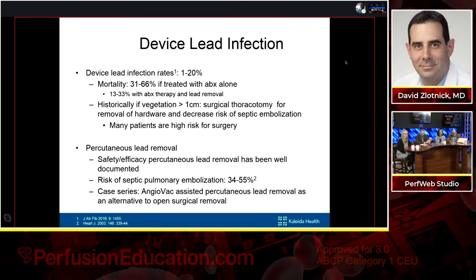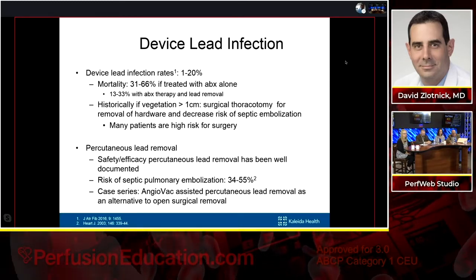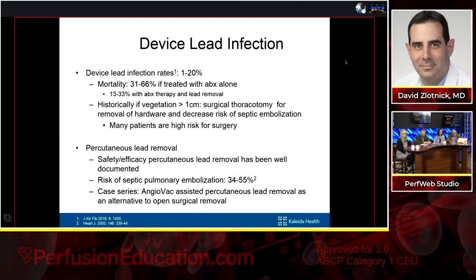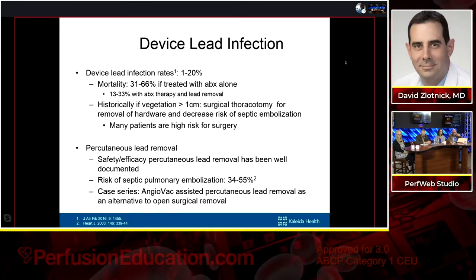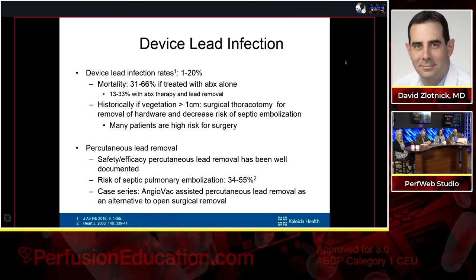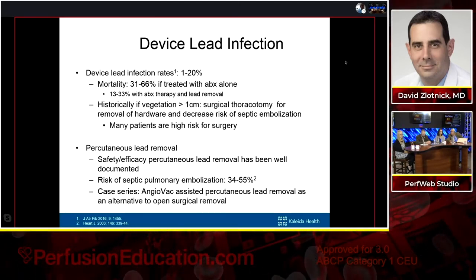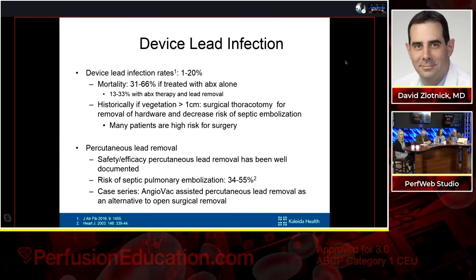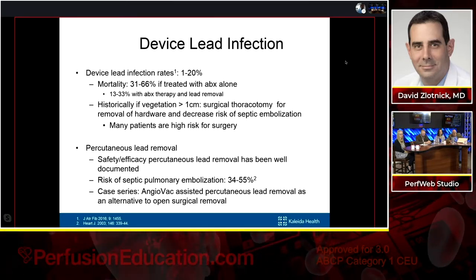So historically, if a vegetation is greater than 1 centimeter, surgical thoracotomy for removal of the hardware is performed to decrease the risk of septic embolization. However, if you think about our population, especially the aging population, who's getting pacemakers and defibrillators? It's usually the elderly. And these are high-risk patients to bring back for surgical thoracotomies and sternotomies. So percutaneous lead removal has been developed as a safe and efficacious alternative to open surgical procedures.